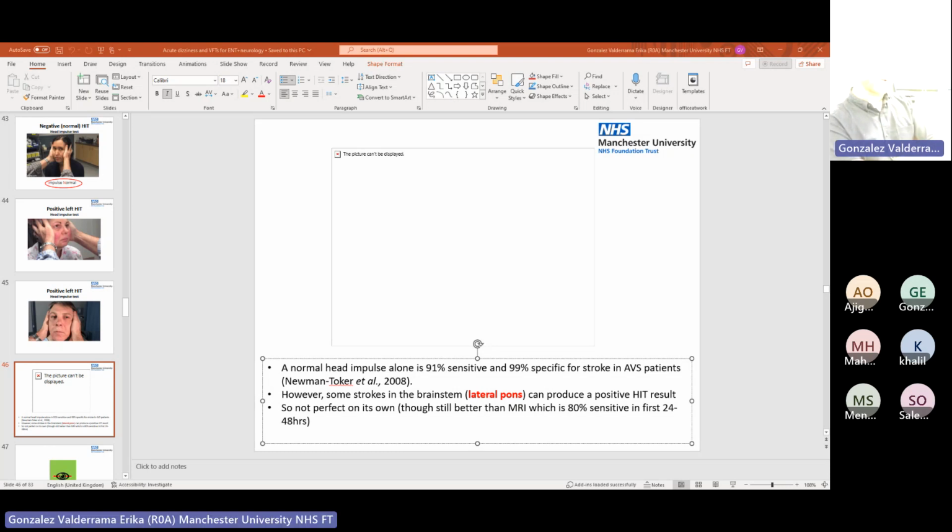So this guy, I don't know if you can see that, but as he looks to the left, the beat is to the left. As he goes over to the right, the beat is to the right. Can you see how that changes direction?